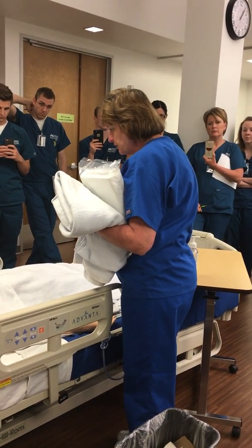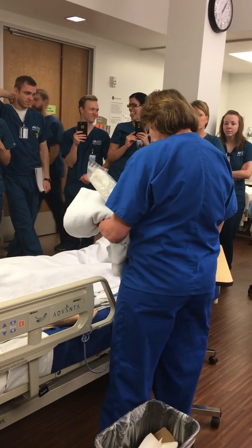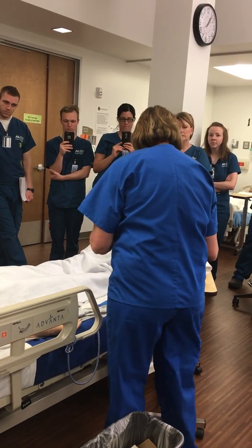Is now an okay time to do so? Yes. So what I'm going to do is I'll go ahead and I will provide for privacy. I'm going to wash my hands.